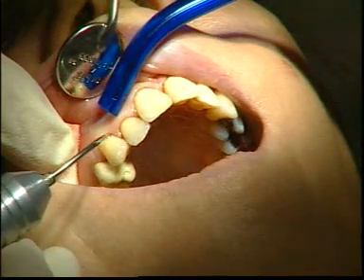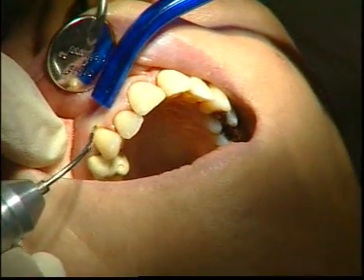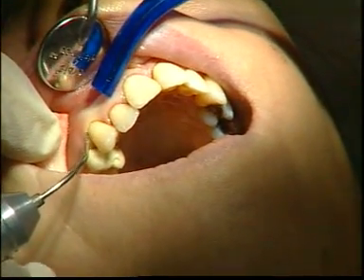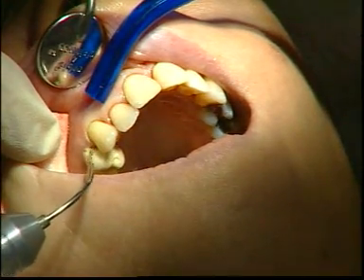Decontamination and modulation of the periodontal pockets is carried out first. A much more attractive aesthetic relationship between the outer dental contours and the adjacent gingival structures is produced.